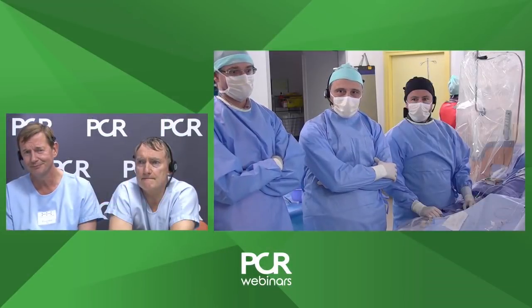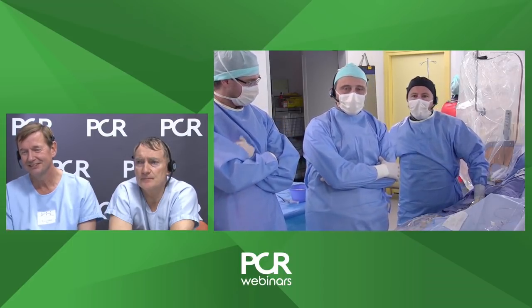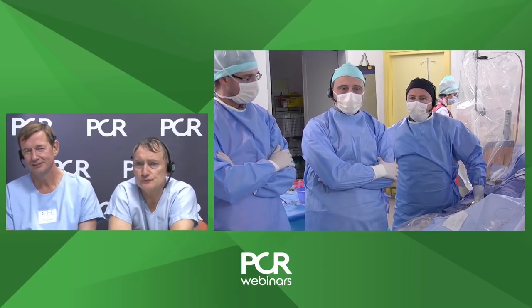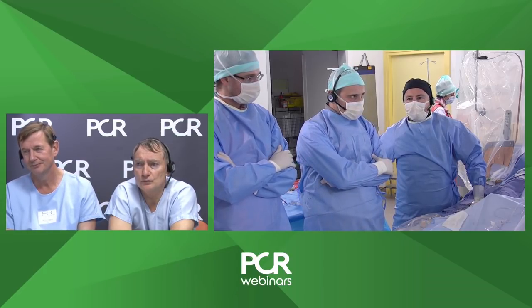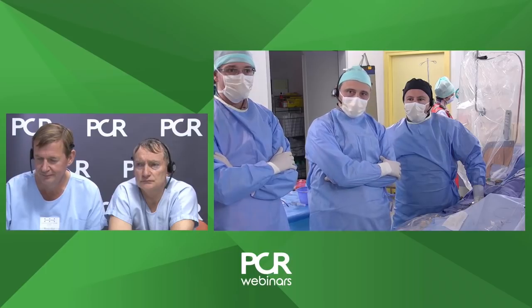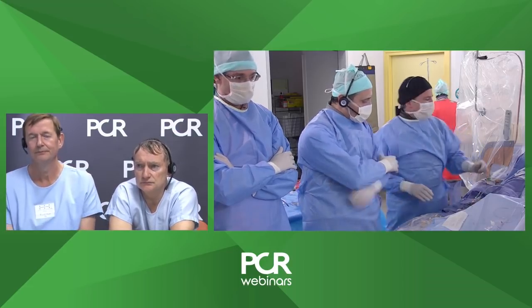Nicolas, I'm very happy to welcome you in our institution, in our cath lab, and I'm very pleased to work with Emmanuel Lavato. I have also present all the team, Lionel, Jeremy, and Patricia, who will help us to perform this case. I hope we will be able to give you a lot of explanation, especially educative explanation. Maybe we can start with the angio. Emmanuel will present the angio.